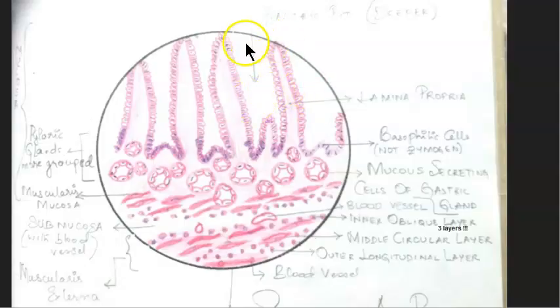At the pylorus, right? Stomach at pylorus, the gastric pits are deeper. And you can see there's more gap here or something they are showing. Okay. The pyloric glands are more grouped, they are saying. Basophilic cells, not zymogen. You have to read this much more in detail.